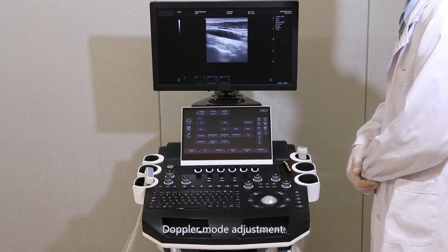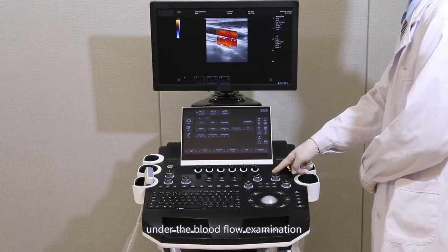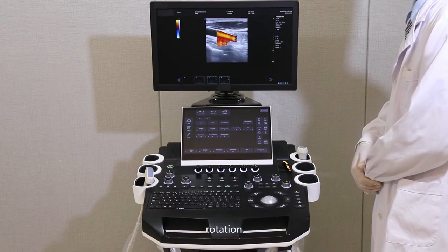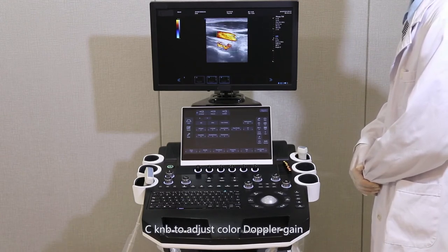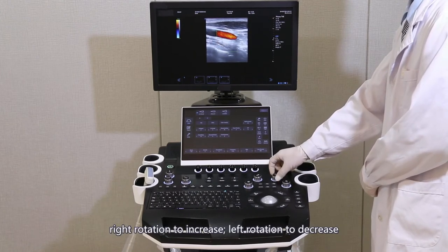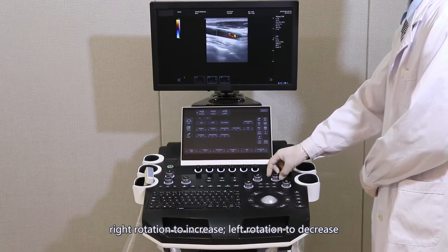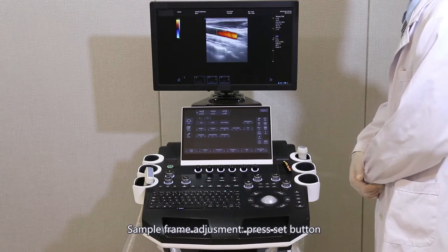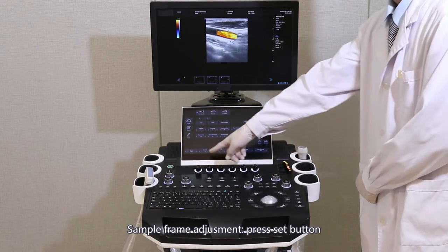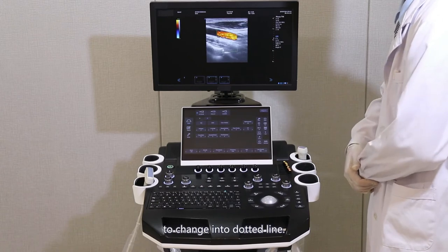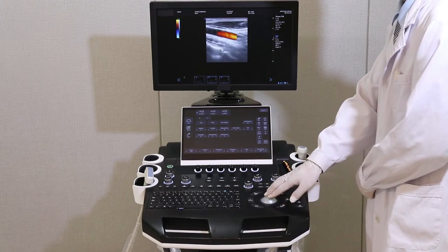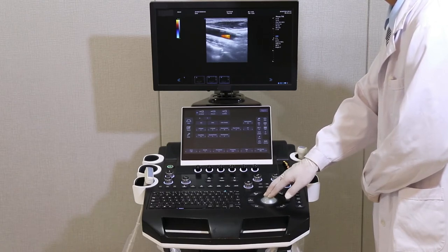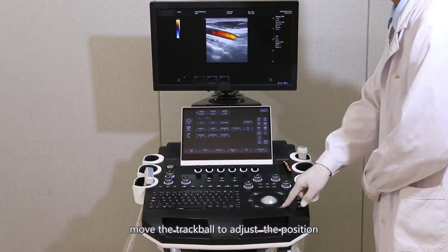Doppler mode adjustment: under blood flow examination, press the C-knob to enter color Doppler mode. Rotate the C-knob to adjust color Doppler gain — right rotation to increase, left rotation to decrease — to ensure the blood flow is full. For sample frame adjustment, press the SET button to change into a dotted line, then move the trackball to change the size.